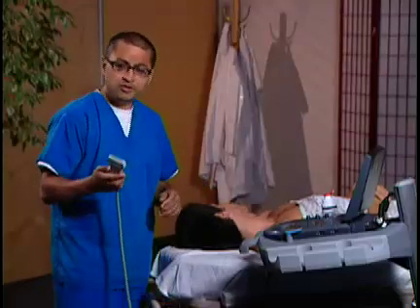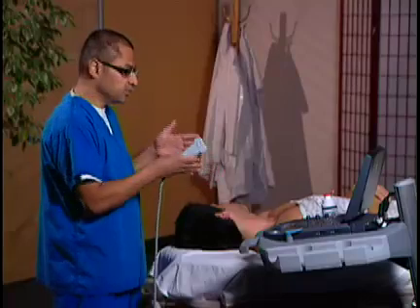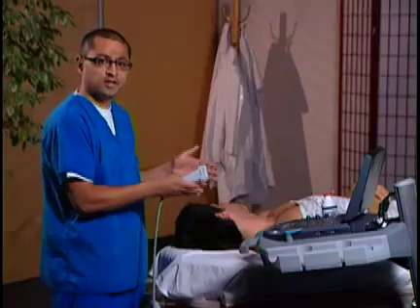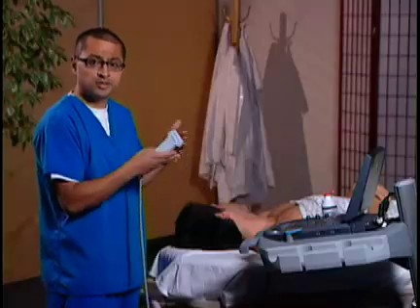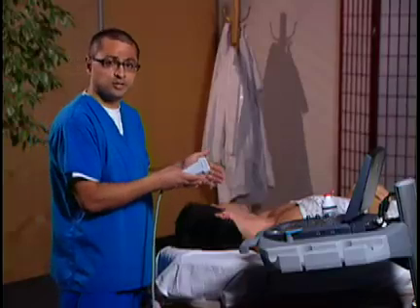We're also going to use a little trick: put the transducer marker to the patient's left. The reason I do this is to maintain the orientation from the head of the bed, so the vein and the artery are in the normal anatomic positions — not to create more confusion when using ultrasound for guidance of a procedure.